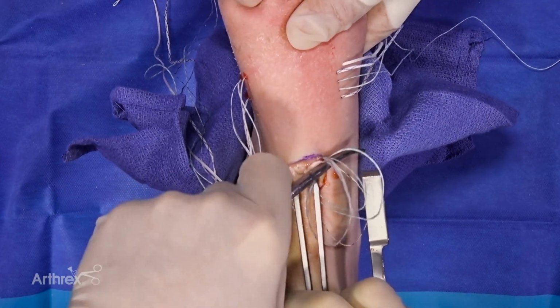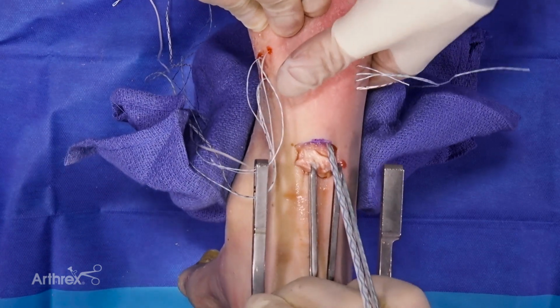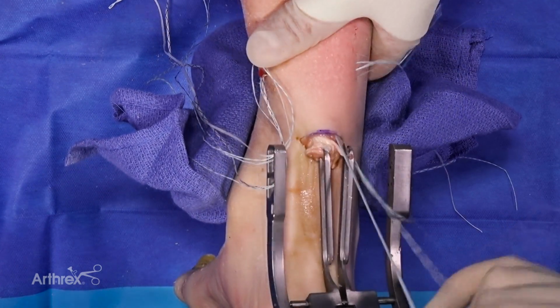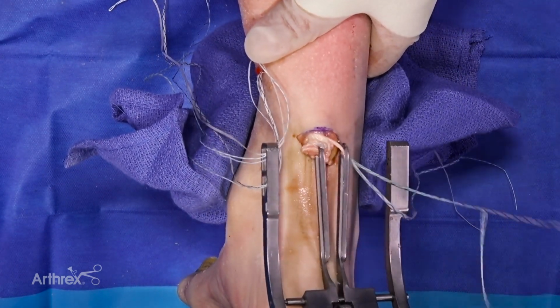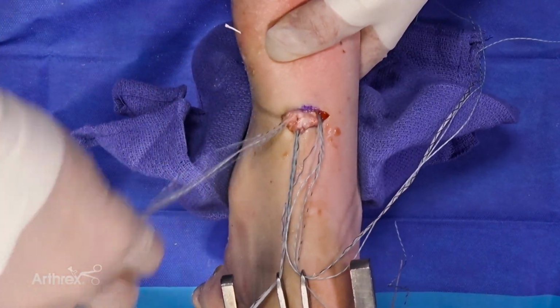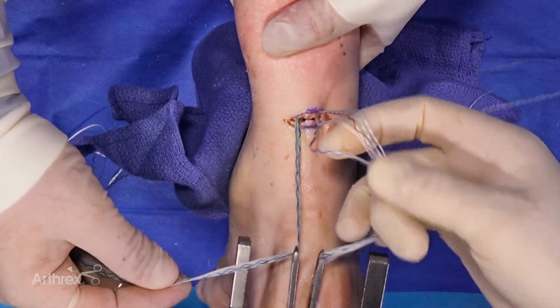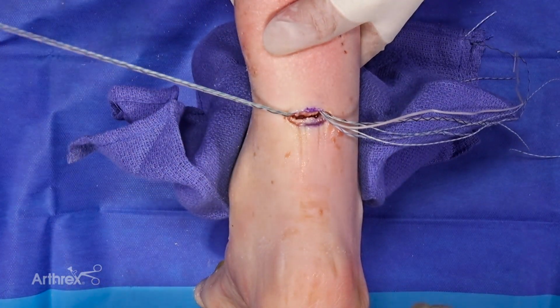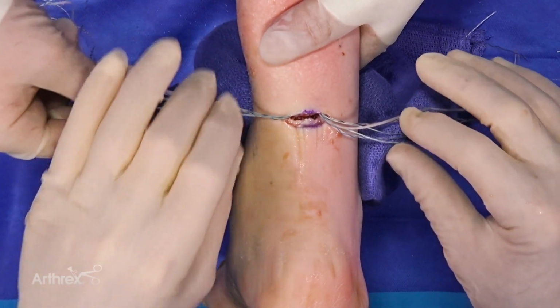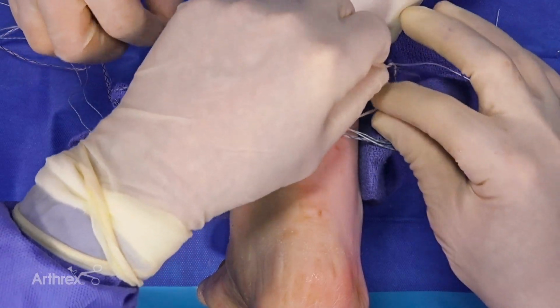You want to make sure that you keep all your sutures in proper order and on the proper side of the Achilles rupture. And we'll do the same thing for the other side. But by having one free now, and again, because suture management is so important here, I keep everything in the jig until I've got it all released, and then I separate them off to the side. So now what you have to do is recreate the order that you put them in. So we'll have our white on top and black at the bottom.